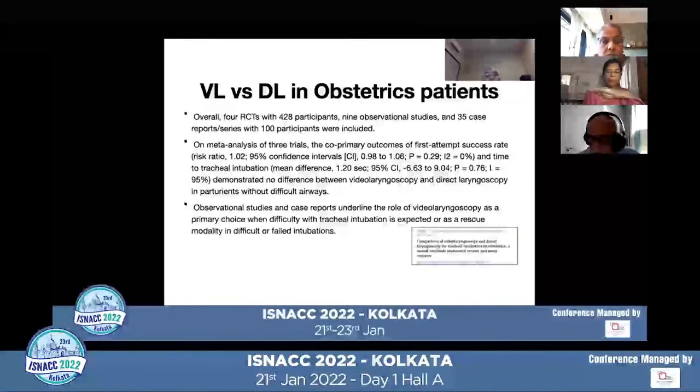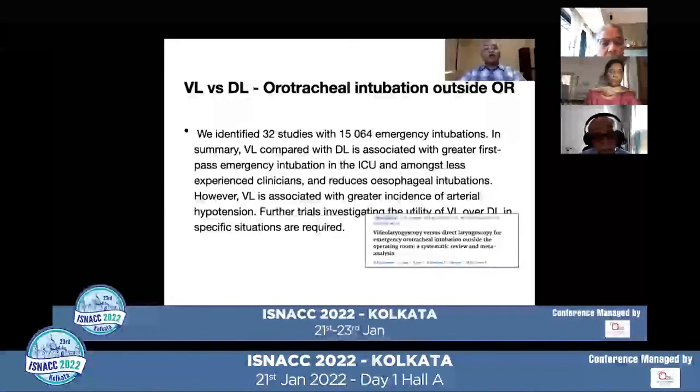In obstetric patients, 4 RCTs with 428 participants, 9 observational studies, and 35 case reports were included, where 100 participants were there. First pass success rate and time for tracheal intubation demonstrated no difference between video laryngoscopy and direct laryngoscopy in patients without difficult airway. But observational studies and case reports underline the role of video laryngoscopy as a primary choice when difficulty with tracheal intubation is expected, as a rescue modality, or in difficult or failed intubation.